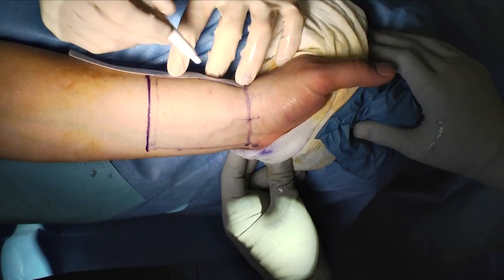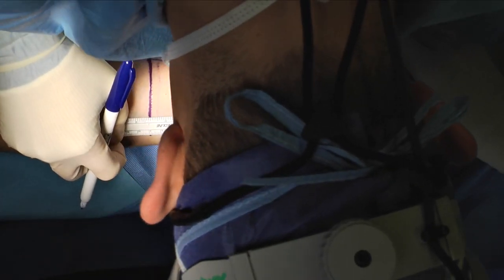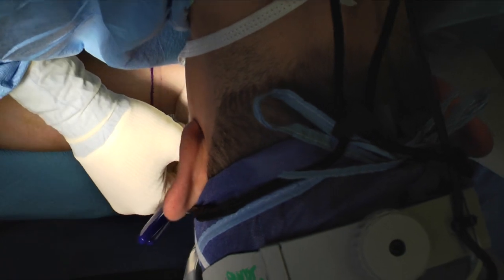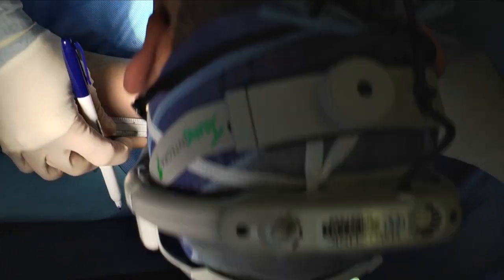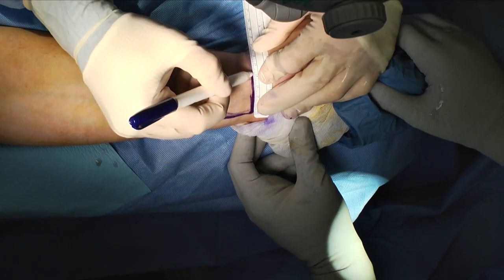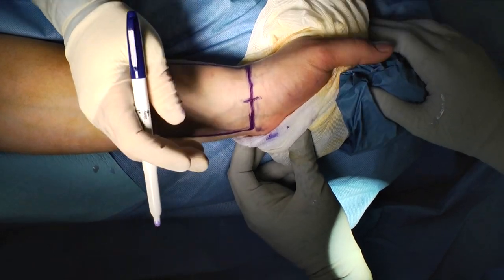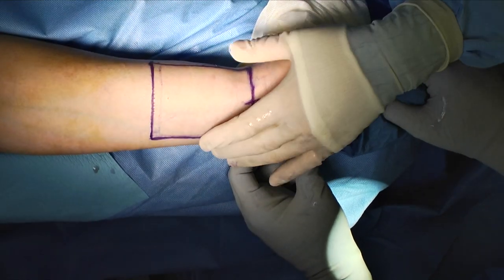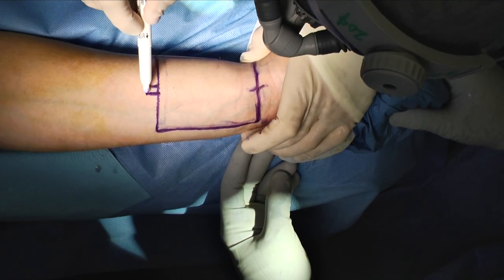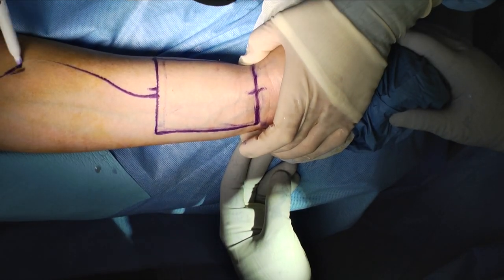After the removal of the patient's tumor, we proceed to the left forearm in this case to harvest the patient's radial forearm free flap. The decision to use the patient's left arm is because he's right-handed and will likely need his right hand to write, communicate, and function in the immediate post-operative period where his left arm is less dominant.